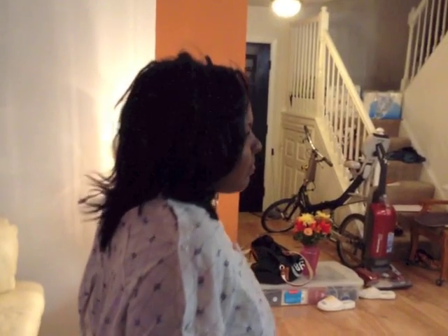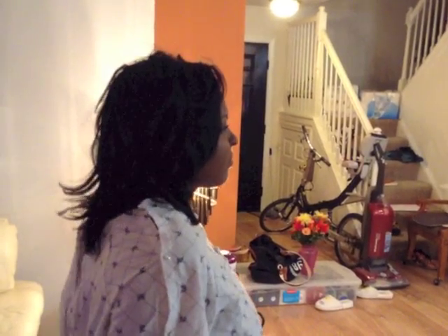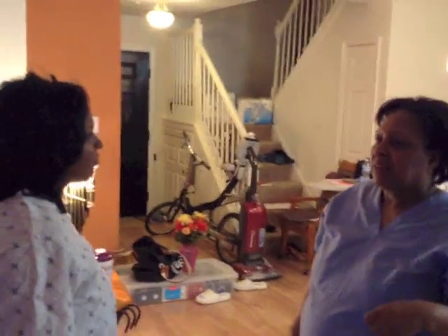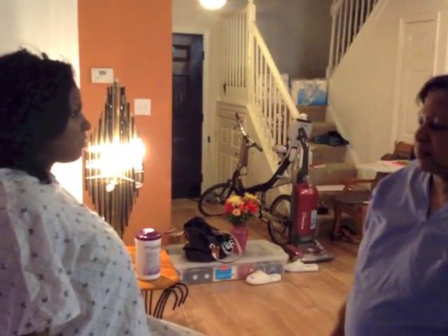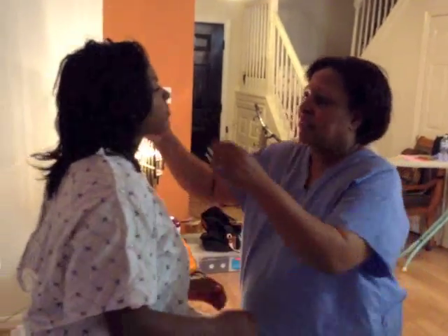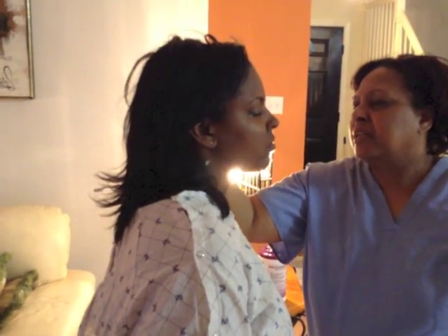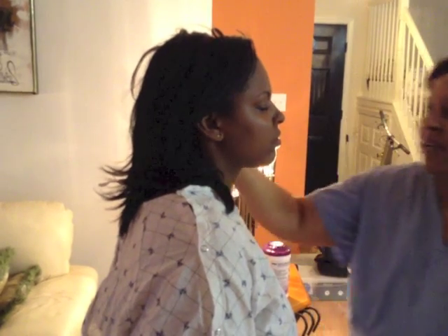Okay. I will always inspect the macula last because if I put the light on the macula, what will happen is that you'll have tears coming down if I do that first. That's the last thing I should inspect. Now I'm going to look at your ears. Inspect your outer ears. Inspect your pinna. No exudate. It feels good.